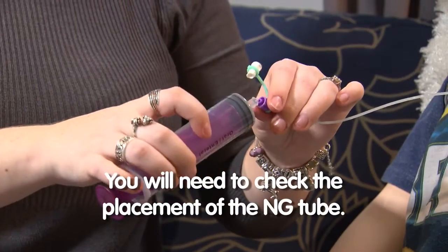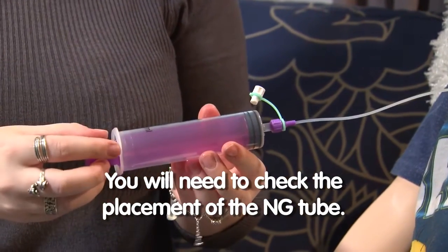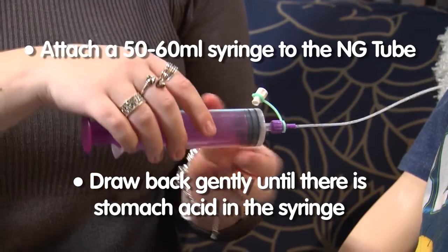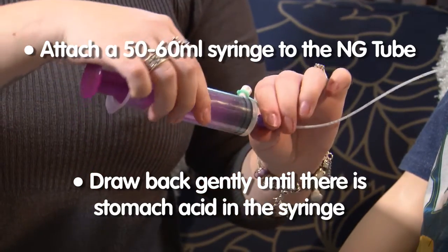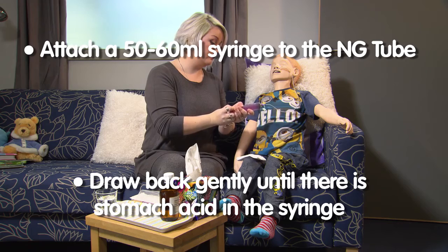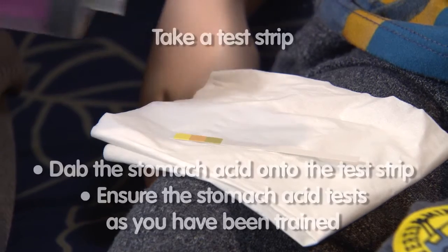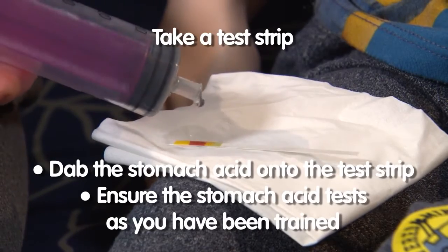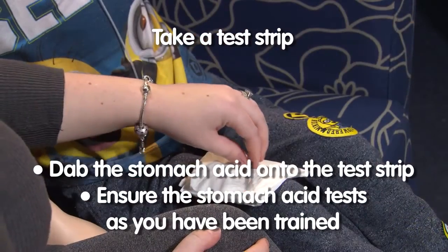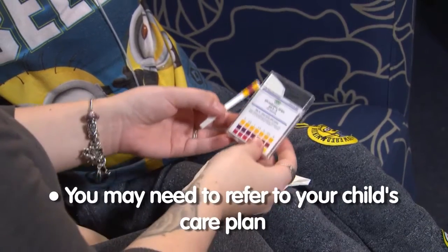Before giving the medicine you will need to check the placement of the NG tube. Attach a 50 or 60 ml syringe to the NG tube and draw back gently until you get stomach acid in the syringe. Take a test strip and dab the stomach acid onto the test strip and ensure it tests as you have been trained. You will need to refer to your child's care plan.